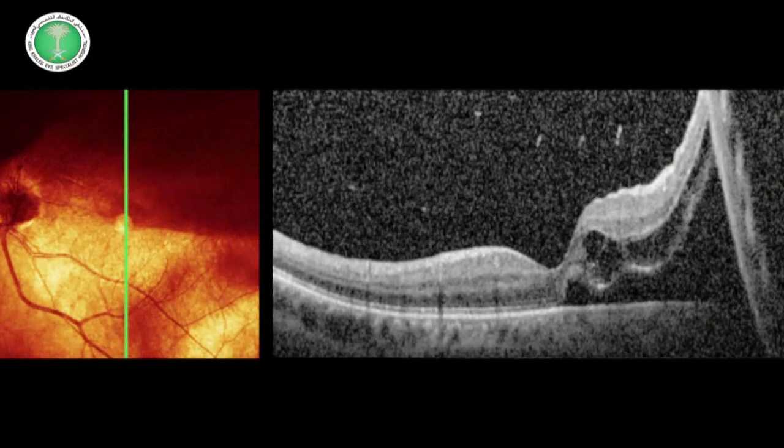This is a case of rhegmatogenous retinal detachment with macular involvement, caused by an atrophic hole as shown with the help of scleral depression.